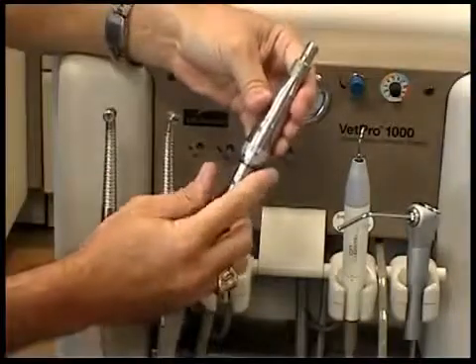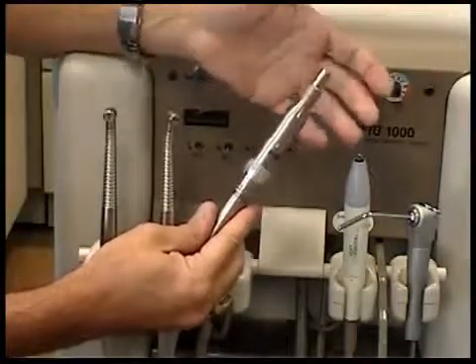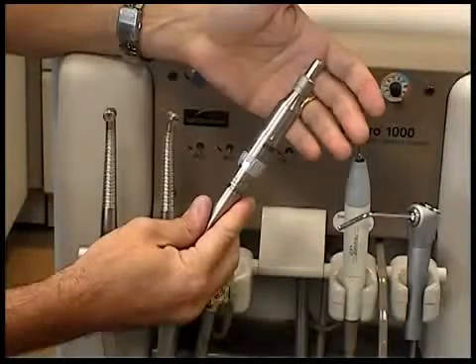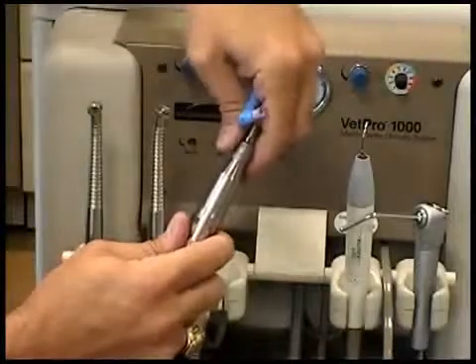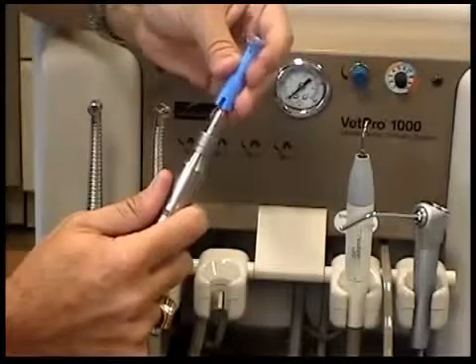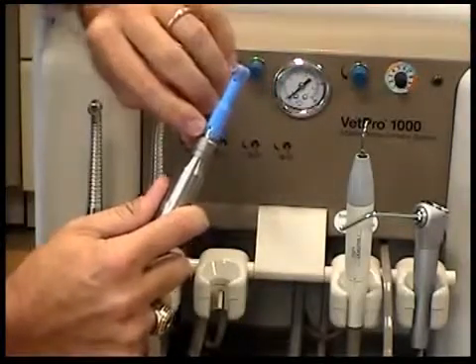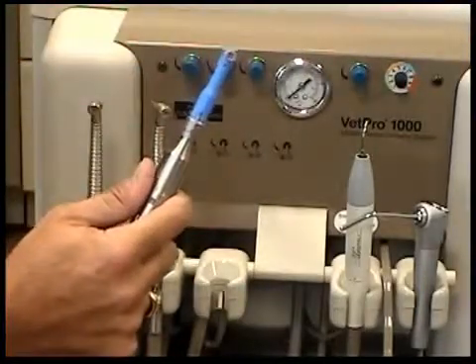Pull back the quick connect collar, fit the rest of the handpiece onto the swivel adapter, and release the collar to complete the connection. On the low speed handpiece, there's a dial that's a different color metal from the rest of the handpiece. This is the directional dial. This dial allows you to select from the three positions of this handpiece: forward, neutral, and reverse. The notches toward the bottom of the dial indicate your position.